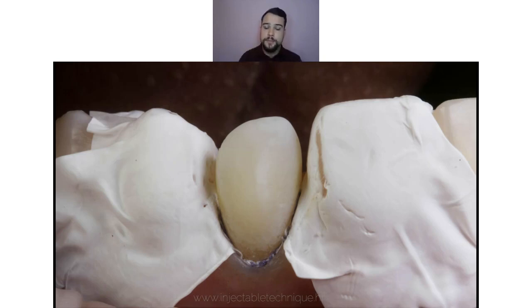We retract the lips with the retractor, but also I'm covering adjacent teeth with Teflon and placing the cord in the initial part of the sulcus. In most cases, I use a cord. In some situations, it's not possible, so it's not mandatory. This is one of a few modifications that I describe in a Quintessence International publication, and I will try to share more of those modifications with you today. I'm using some regular dental cord, but placing it in the initial part of the sulcus, not too deep, not to retract the gingiva, but to make a barrier between the external and internal, or the sulcular part.